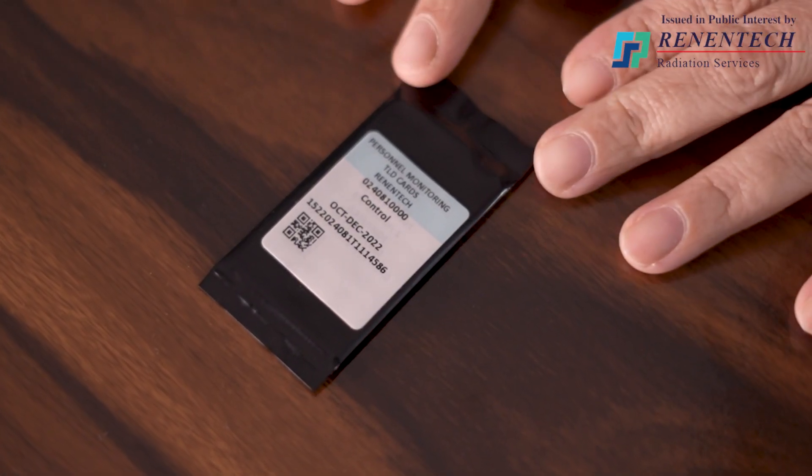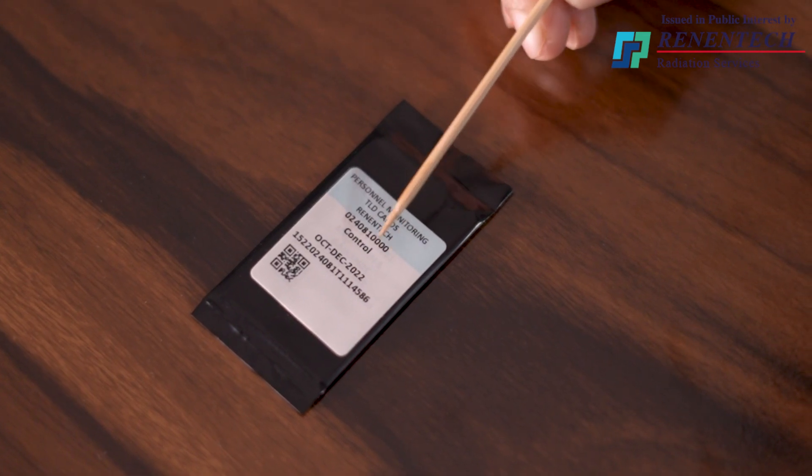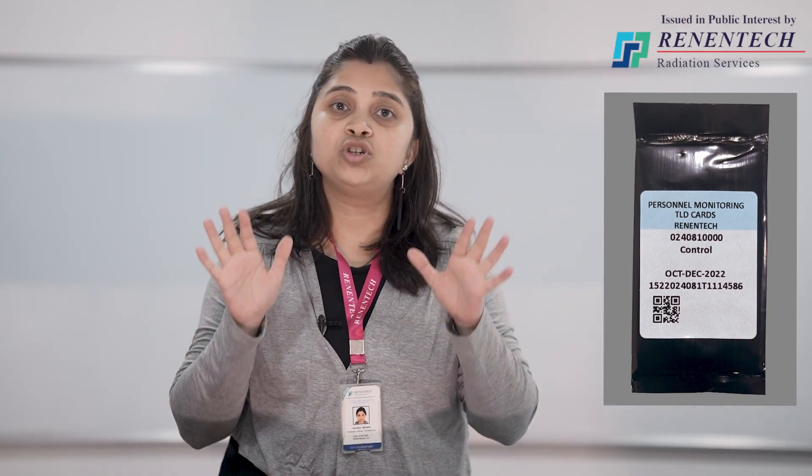Now we will have some information about the control card and storage of TLD cards. For each and every service period, along with the person card, we always send a control card. A control card has the word 'control' written on it and instead of a person number, four zeros are there. The control card is sent to note down the background radiation level of the area in which your organization is located. Therefore, under no circumstances should the control card be stored or kept on the control panel of any radiation-generating machine — it should not be exposed to any radiation other than the background radiation level. It must always be kept under lock and key.